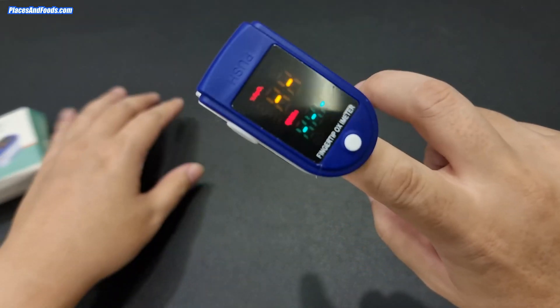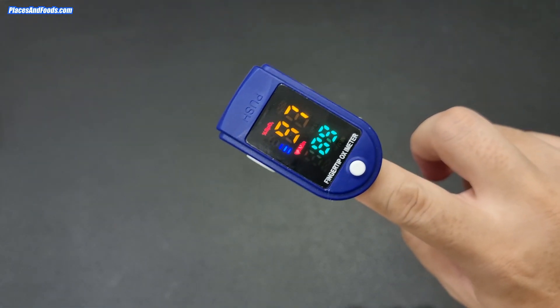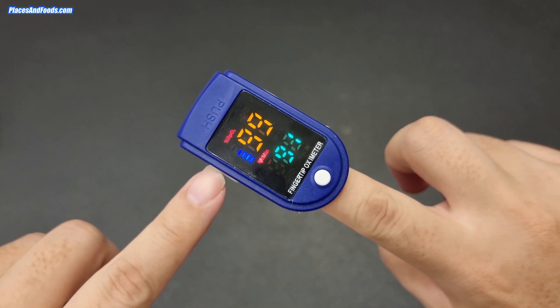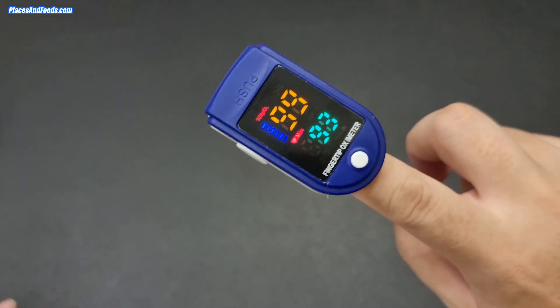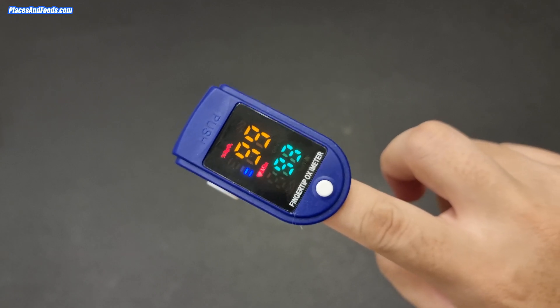To turn it on, you just turn it on like that. You can see there's an infrared sensor — you just leave your finger there for a couple of seconds and it starts to read. What you can see here is the oxygen level in the blood, and then that's the pulse.